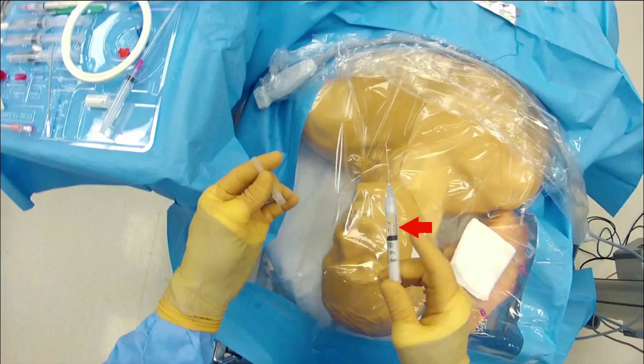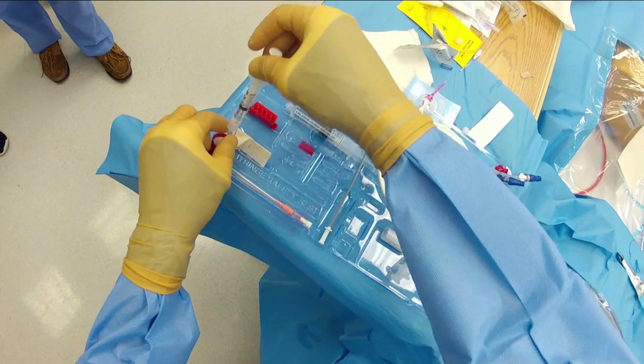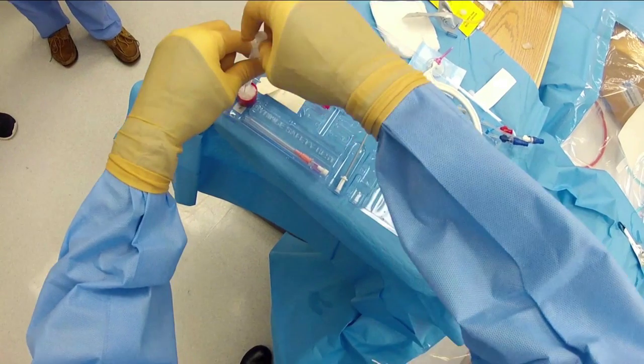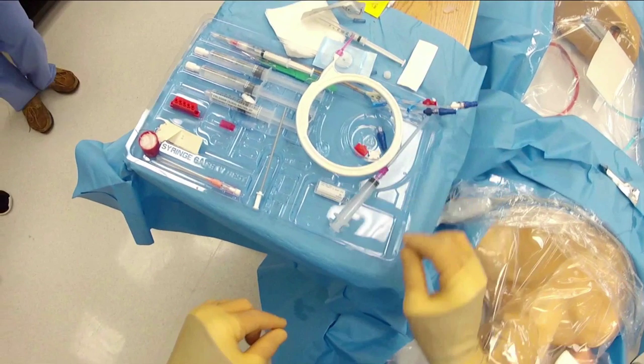Something to note on the lidocaine syringe: there is a small peg at the end of the plunger, and this is for the needle safety technique for this type of syringe. Once all the lidocaine is injected, that peg engages and when you pull the plunger back it pulls the needle within the barrel of the syringe. The needle is no longer exposed and you won't accidentally stick yourself, however the syringe is no longer usable. That's why there are two lidocaine syringes — one for the procedure and one for the skin for suturing.